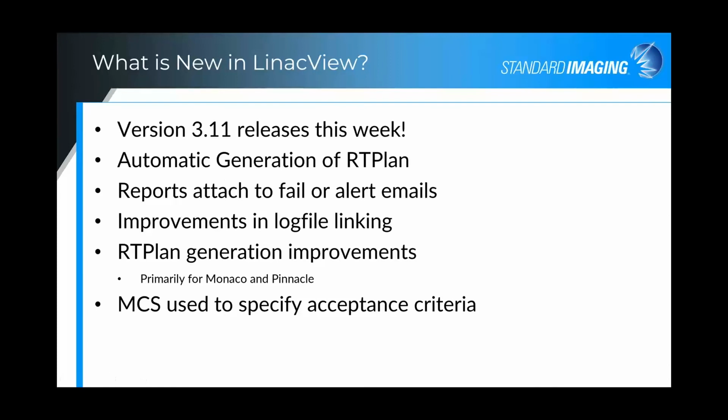Before, it was a manual process. If you found an alert and wanted to go in and generate the RT plan and recalculate in your treatment planning software, that was a manual process. Now you can set that up to export with each and every plan. And so you can, of course, as I mentioned earlier, automatically recalculate all those generated RT plans as delivered.